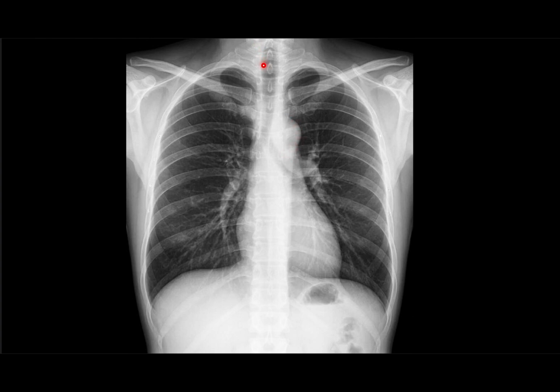This tubular structure here, that the inner part is a bit dark, this tubular structure is the trachea. These are the thoracic vertebrae. Projecting from their posterior part, the spinous process of the thoracic vertebrae. This is the gastric bubble, formed by the air contained in the fundus of the stomach.